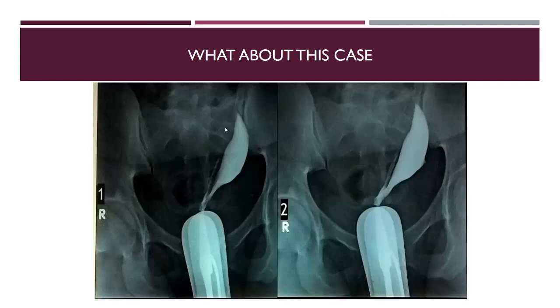Again, this is a large uterine cavity and it is pushed to the left side. But here, when we push the uterus, we find that there are two openings of the fallopian tube. This is one and this is another one. So this is a misplaced uterus, but it is enlarged, and it may be due to a fibroid also.